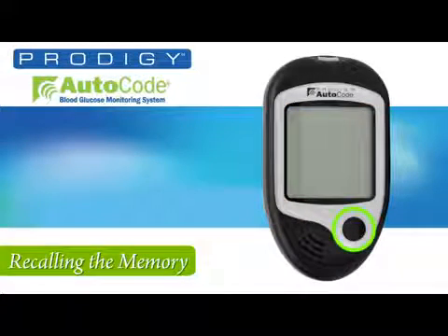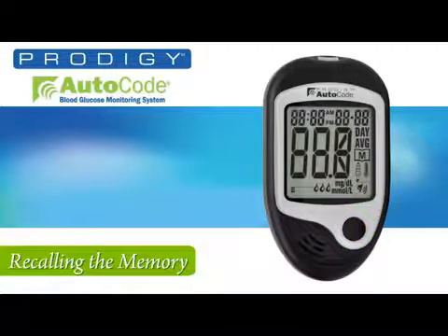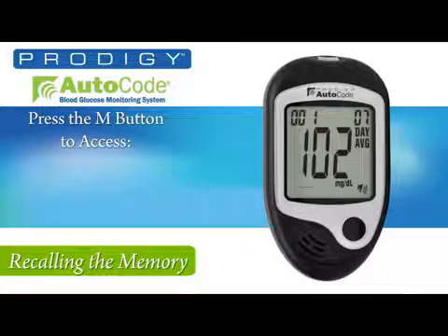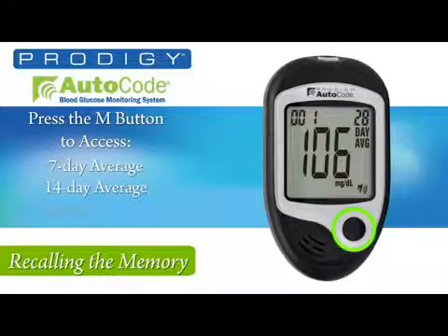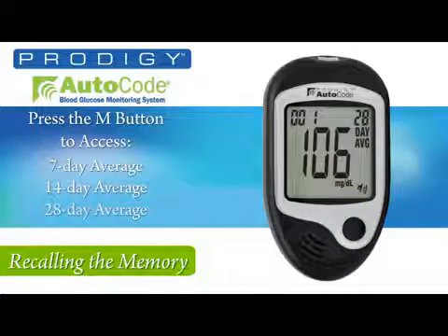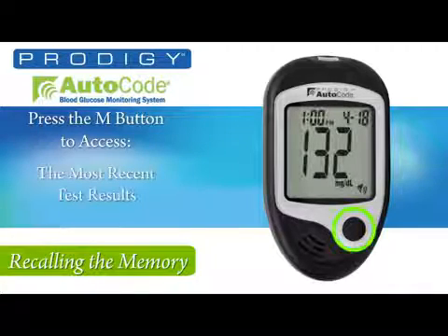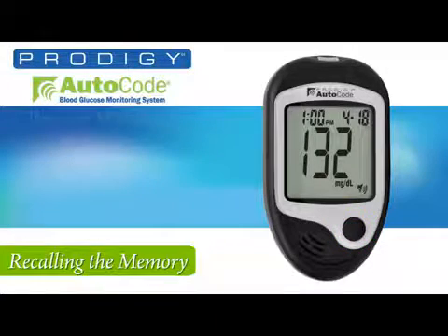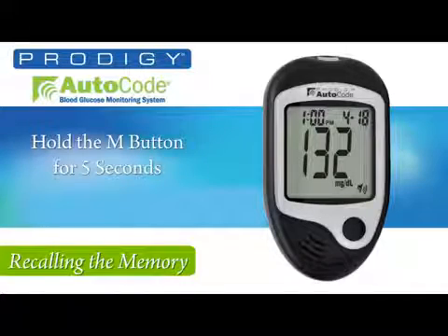To recall test results, press the M button while the meter is off. After you hear the intro message, press the M button again to enter memory recall mode. The meter will report the 7-day average first. Pressing the M button advances to the 14 and 28-day averages. Press the M button again and the most recent individual test results will appear. Continuing to press the M button will provide a maximum of 450 test results. To exit memory mode, press and hold the M button for 5 seconds, or leave the meter alone for 2 minutes and it will turn off automatically.